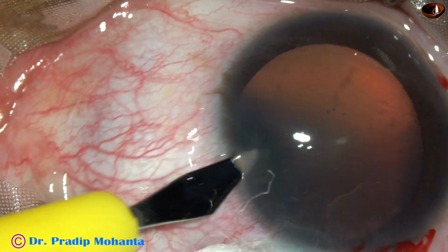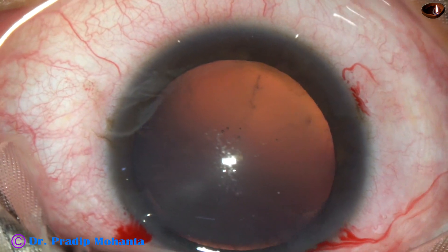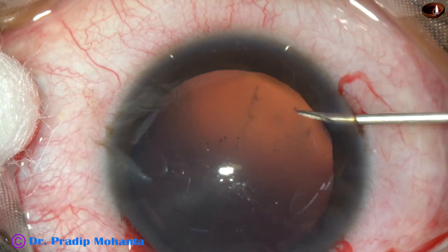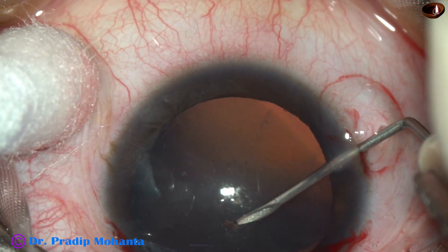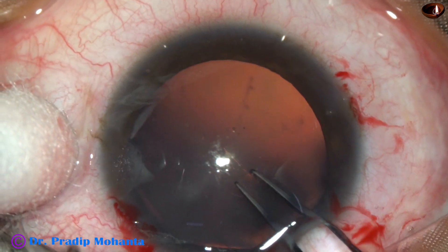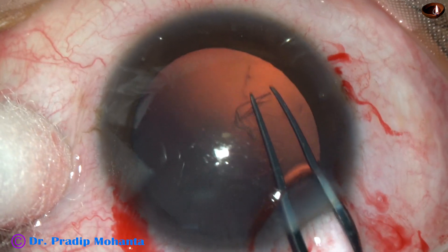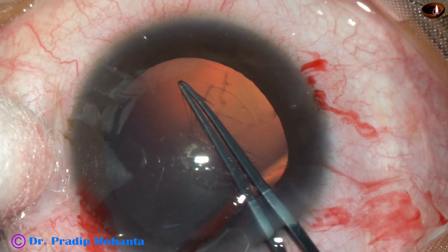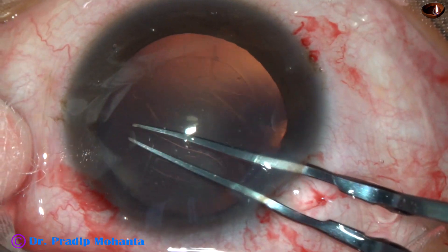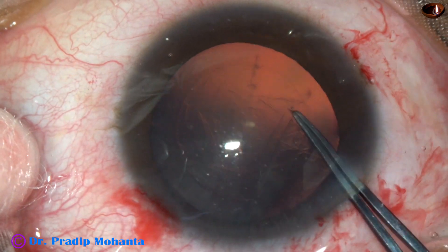And this is another side port on the left side, about the same distance away. Now the anterior capsule is incised with a 26-gauge bent needle cystitome. The capsular tag is held with the help of a utrata forceps. I go at the rhexis, remaining at a certain distance away from the margin of the dilated pupil, and thus I do an adequate-sized rhexis.